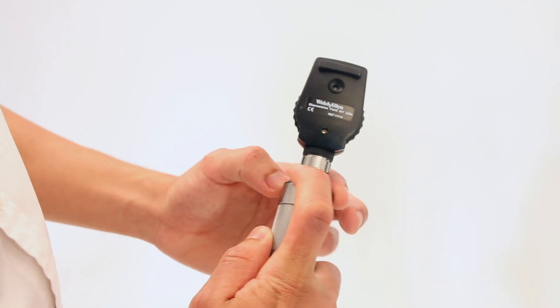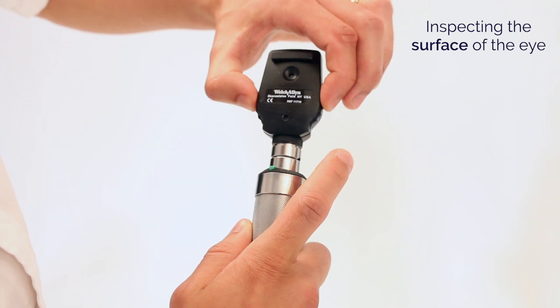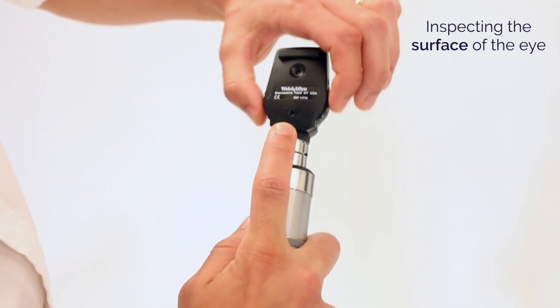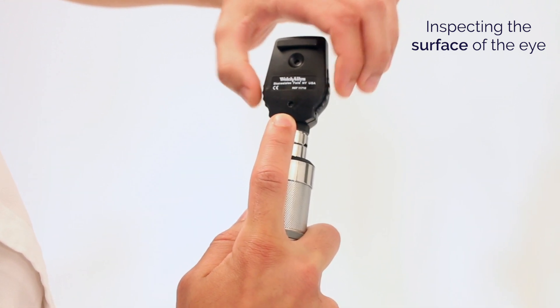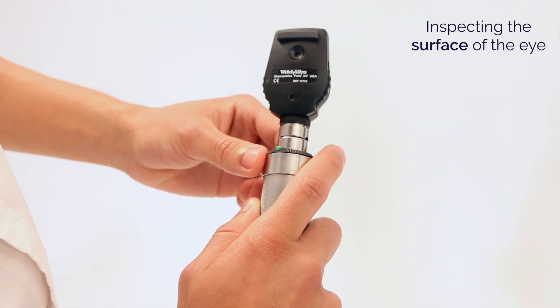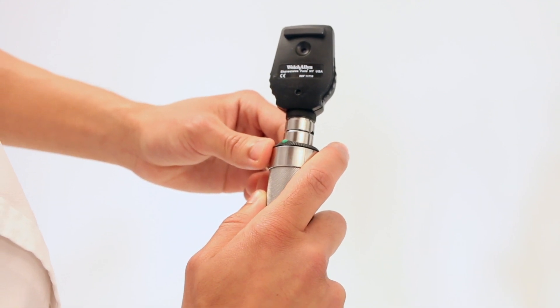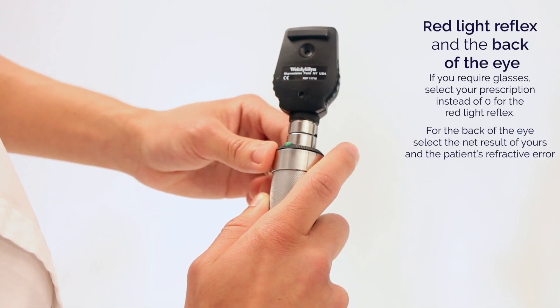To look at the front surface of the eye, you can turn the ophthalmoscope on and change the number on the dial to a green number that is high, either 10 or 15. That changes the ophthalmoscope into a magnifying glass to look at the front surface of the eye.